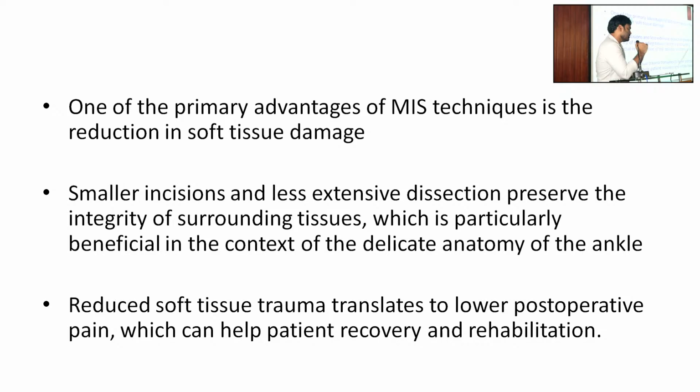But we do not know. In the C-arm, even if it is anatomically reduced, periosteal interposition is very likely in such injuries. But if the displacement is more, there is a chance of it getting in. An undisplaced one, I don't think the periosteum gets in. In this mechanism, the talus gets lifted laterally and then the fracture opens up. Then it goes back into position, and that time part of the periosteum above the fracture line can get into it.